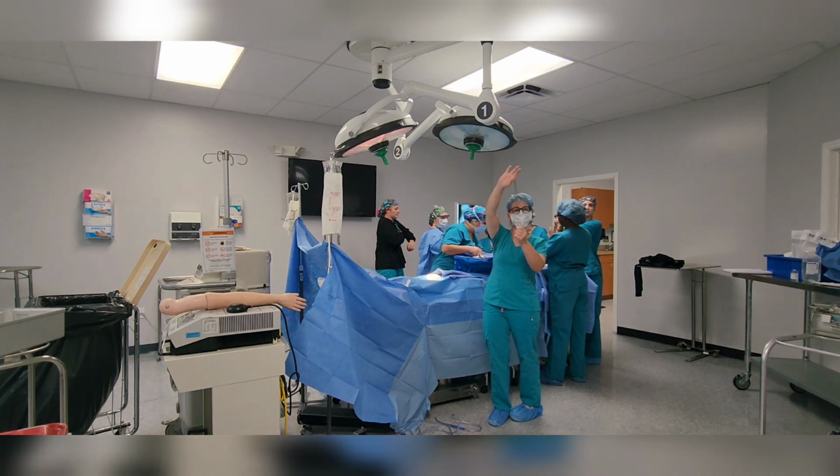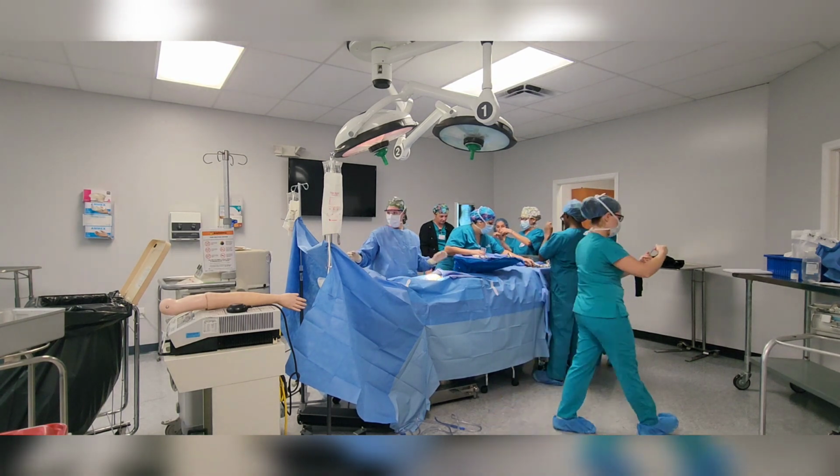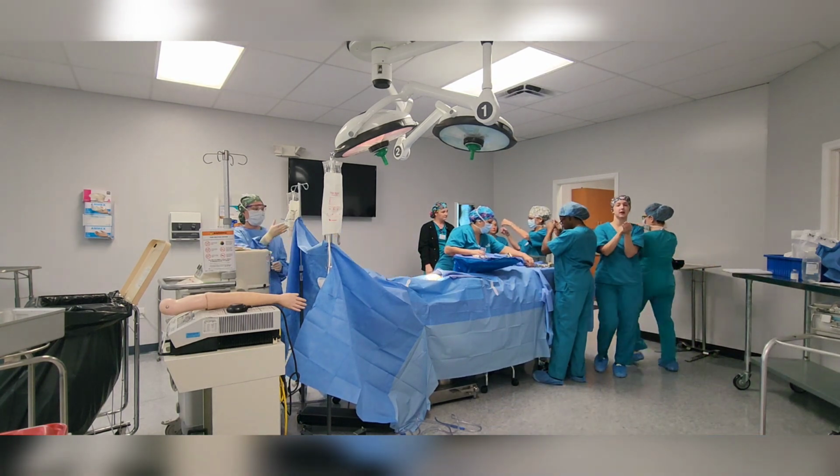Those ties, keep them. Just put them in a peel pack, and we can reuse them.